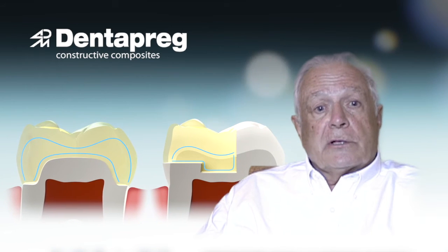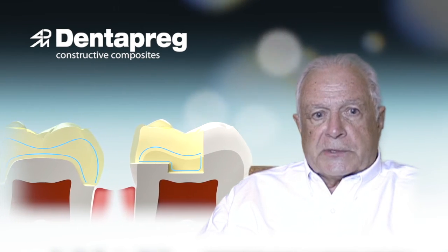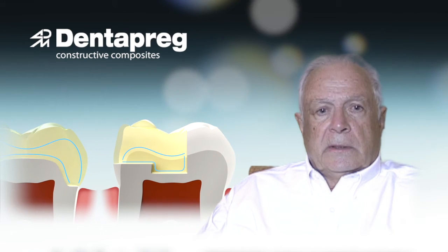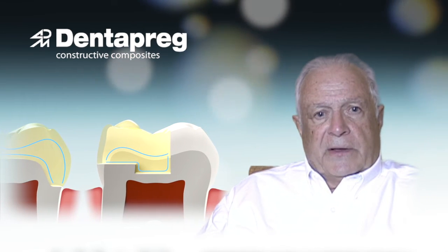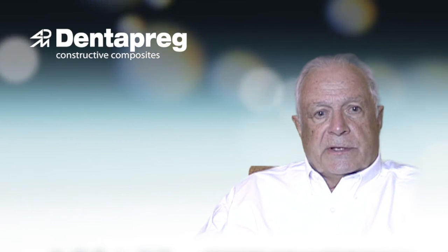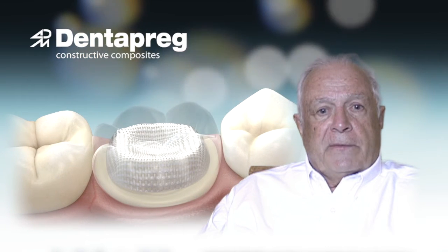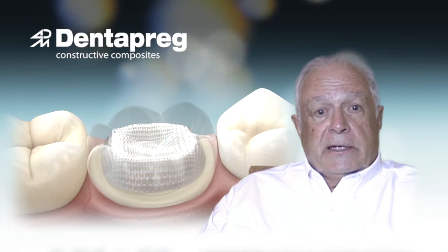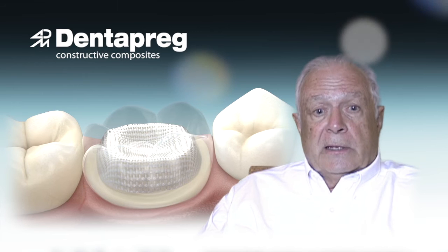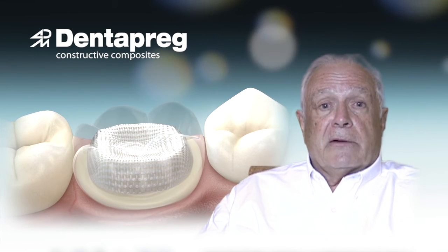Dentapreg is a must for those large four-surface restorations that involve working cusps in the restored tooth. The ideal method to prevent failures of large restorations is to distribute forces from occlusion by placing a layer of Dentapreg UFM — which is ideal for crown reinforcement as well — approximately 1.5 to 2 millimeters below the top layer of the composite.